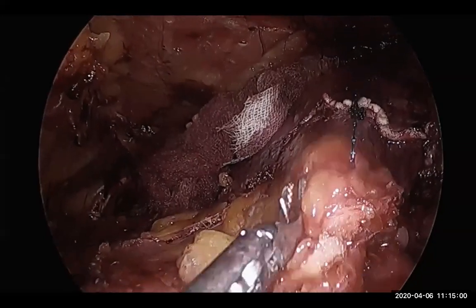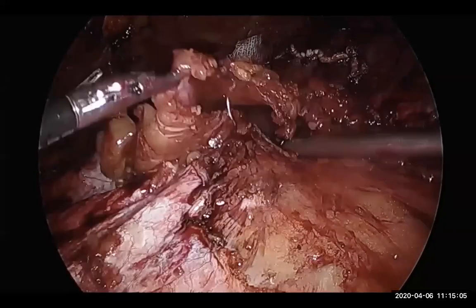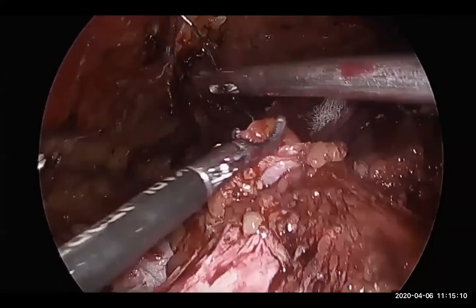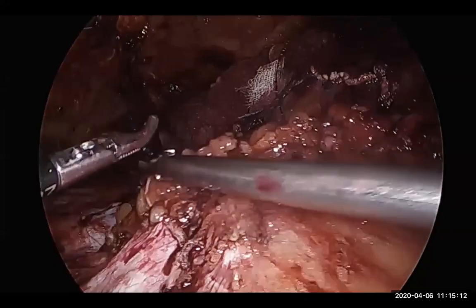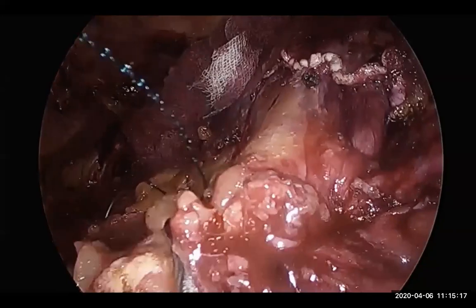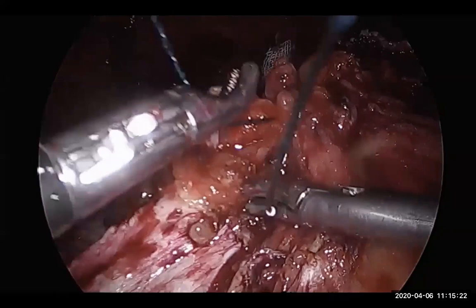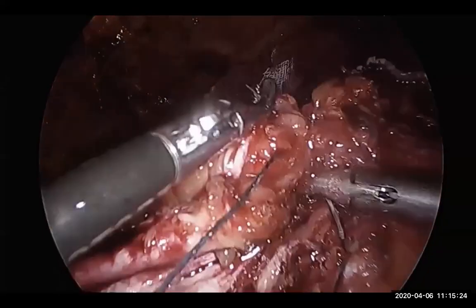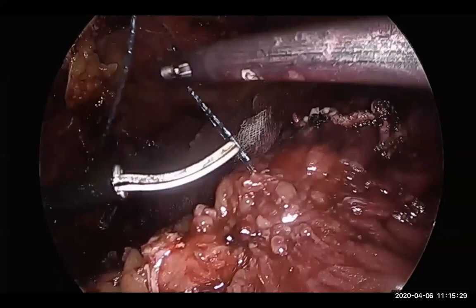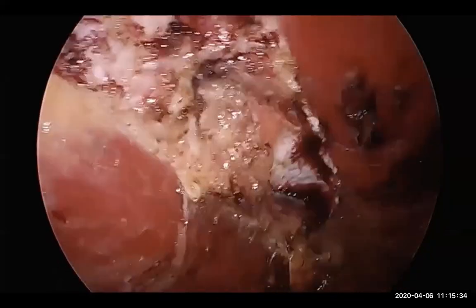So here we are closing the posterior rectus sheath. It's a small gap, so I really don't think it matters much. So these are nice chunky bites to prevent bowel from coming out between the stitches and from the stitches cutting through. So that's closing a small bit of peritoneum. And this is the reverse bite that locks the V-lock suture. So that takes care of the PRS.